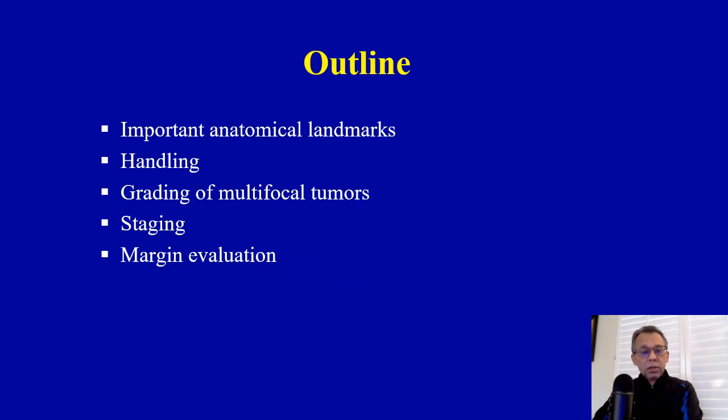So here is my outline for the talk. I will talk about important landmarks, handling, grading of the multifocal tumors. I will talk about staging, and then I will also talk about the margin evaluation.